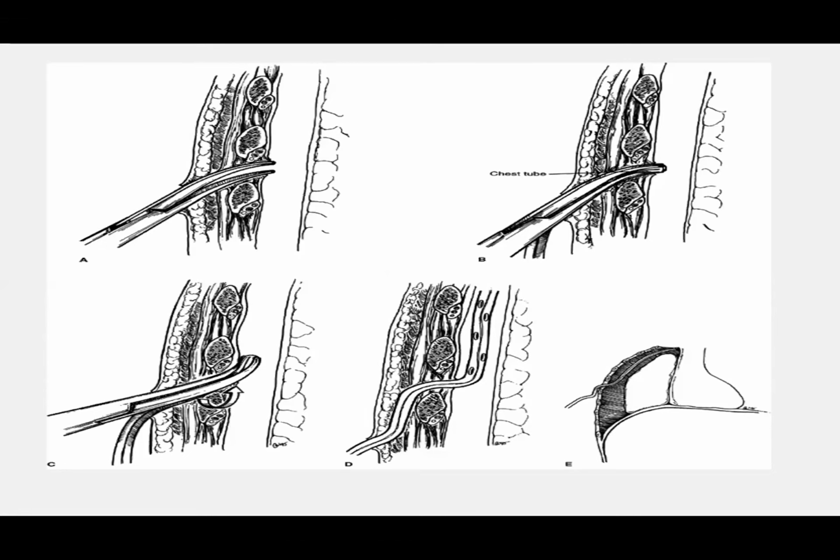Then after that, you will do a semi locking of this knot. Okay, so I have to show you a video for that, but most of my residents know it. So basically, whenever you are going to remove the tube, you are going to untie this knot. Okay, then after that you can unwrap the stitch and remove the tube, and you can tie the skin easily.